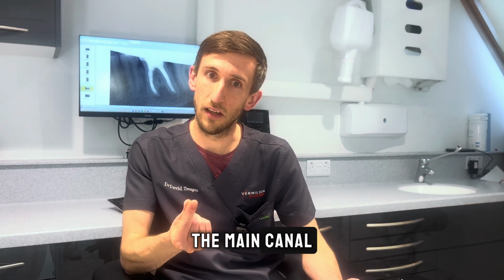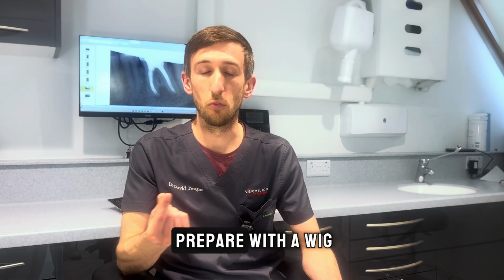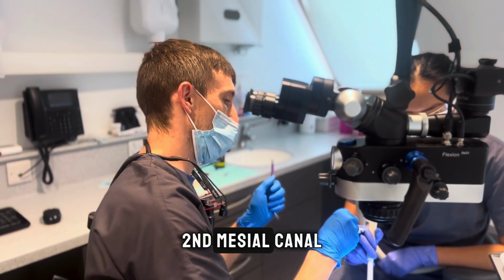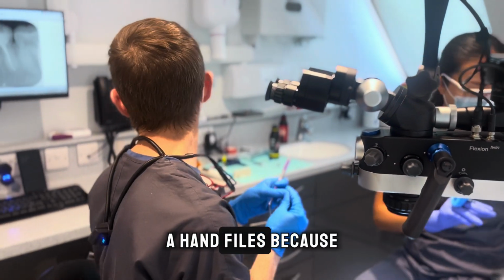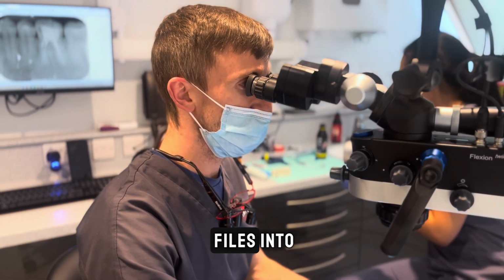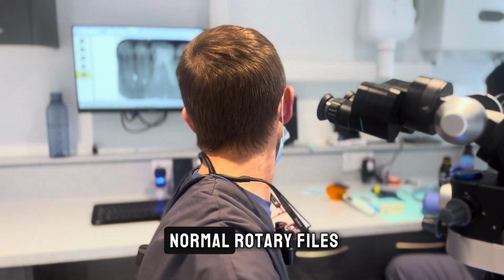The main canal was possible to prepare with a Wave 1 gold files, but on the second mesial canal, I had to use ProTaper hand files because the curve was really quite abrupt and it was really challenging to get my files into that canal system using normal rotary files.